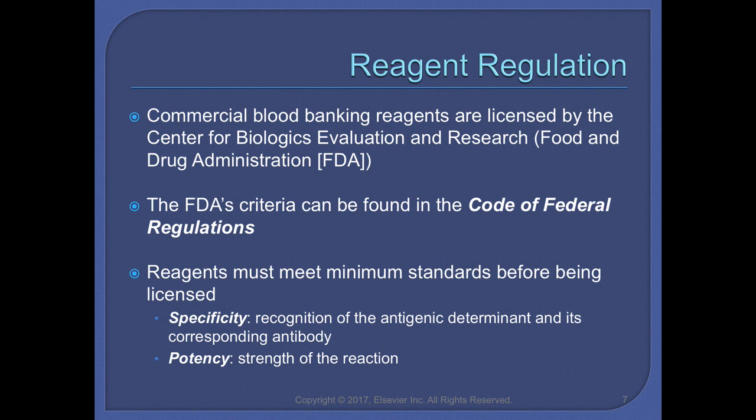A package insert that comes with every reagent should always be included, and the package insert describes in a lot of detail the reagent, the composition of the reagent, the intended use for the reagent, a summary, the principle of the testing.